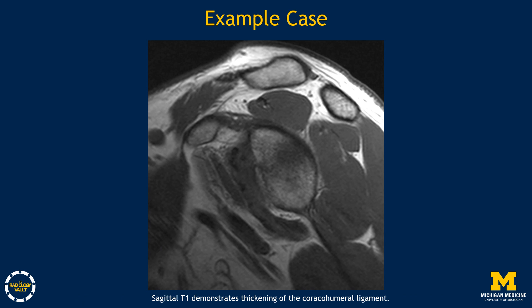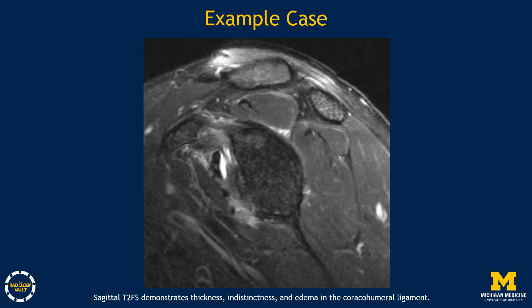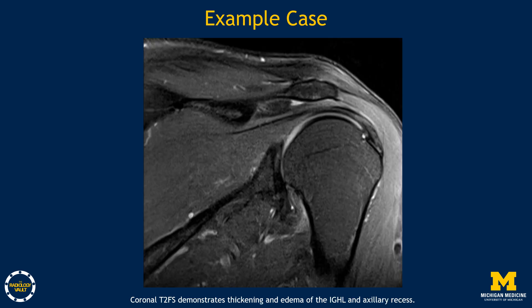This is another example case also demonstrating thickening of the coracohumeral ligament. This example case demonstrates thickening, indistinctness, and edema in the coracohumeral ligament as seen on the sagittal T2 fat-saturated sequence. In this case, we have thickening and edema of the inferior glenohumeral ligament and axillary recess. Compared to the first example case, this is a more common presentation where you do have some thickening, indistinctness, and some edema, but not as profound thickening of the inferior glenohumeral ligament and axillary recess.